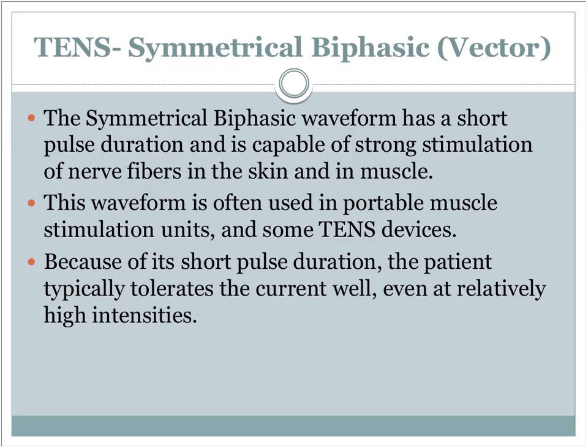Sometimes you can put the TENS on for a while before treatment, and it will actually have a lasting effect. Again, go back to that synaptic junction: you've released all that neurotransmitter in the area, and it's clogging up that whole synaptic junction. Eventually, the enzymes will break that neurotransmitter down, and it will be reabsorbed into the distal end of that synaptic junction, and allow the other neurotransmitter from the pain transmission to get through better. But because it takes a while for that to happen, you do get some lasting effect.